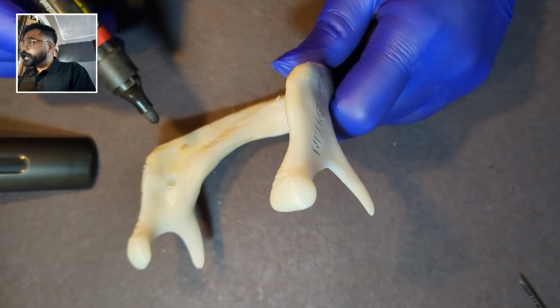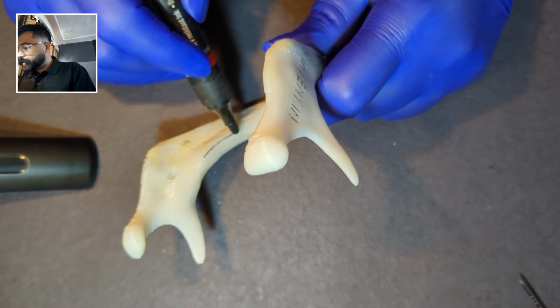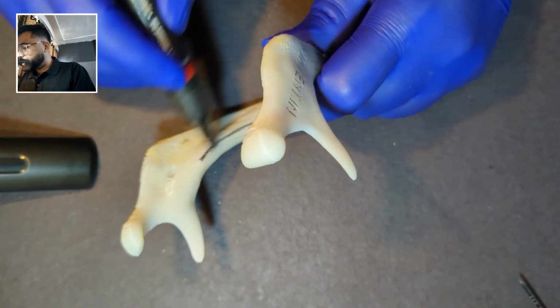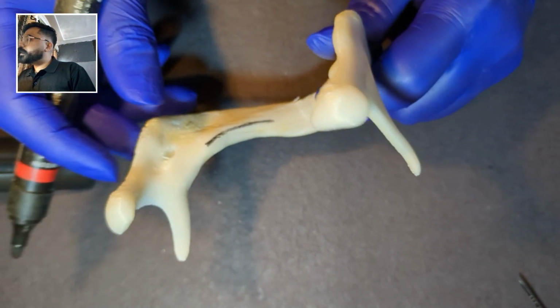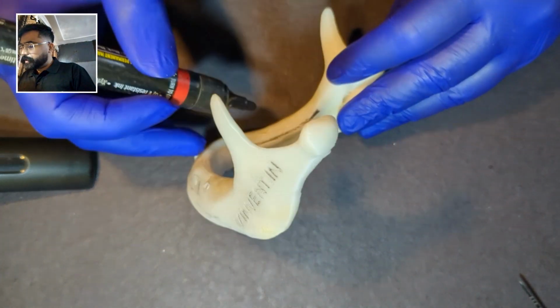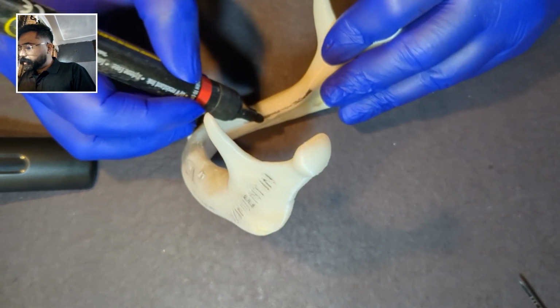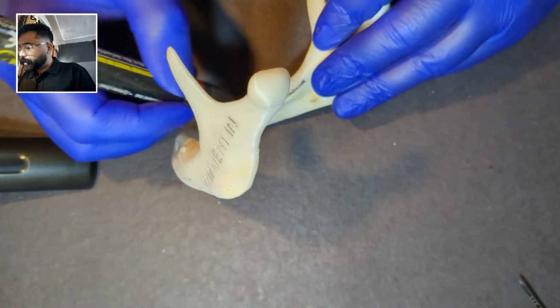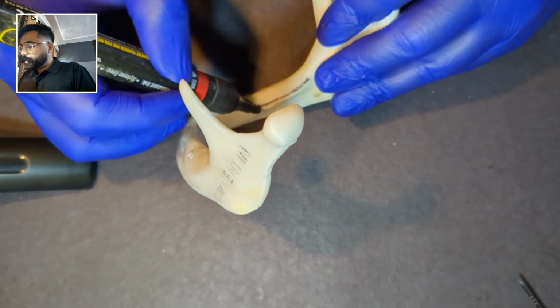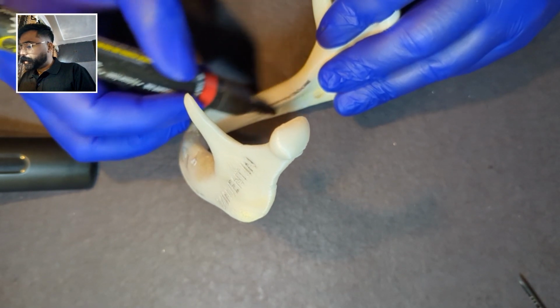So like in this model we can see this protuberance is the mylohyoid ridge. This bony prominence is the mylohyoid ridge. Everyone can see that, right? So in which region is it seen? It is seen primarily from the mandibular first molar's distal root. Its prominence is from the mandibular first molar's distal root, posteriorly onwards, the mylohyoid ridge is prominent.